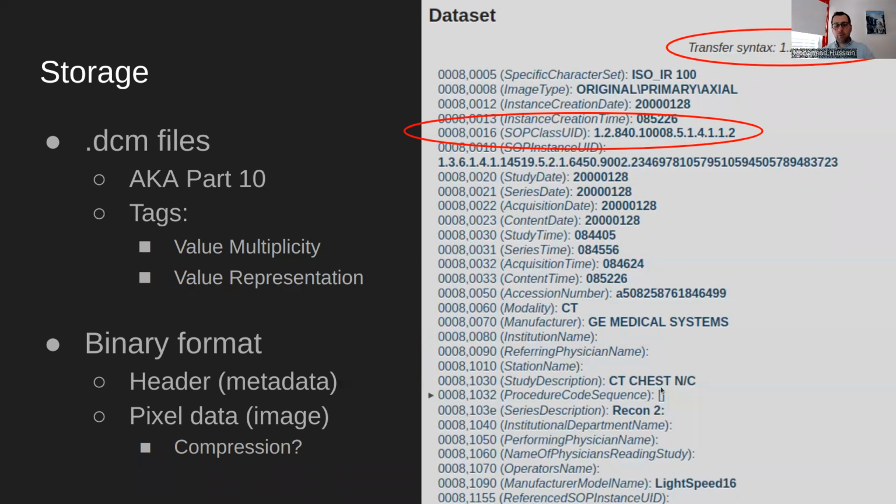Now, one thing you may or may not be able to tell here is that DICOM, the way it was actually created, was really built around a time when human beings did a lot of storage on slow storage devices, exceptionally slow storage devices like tape. And in this case, being able to do sequential reading and being able to calculate how many bytes you want to jump ahead to get to something specific was very important. And that's one of the reasons why DICOM looks the way it does today.